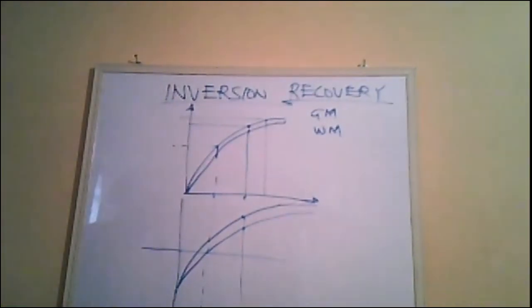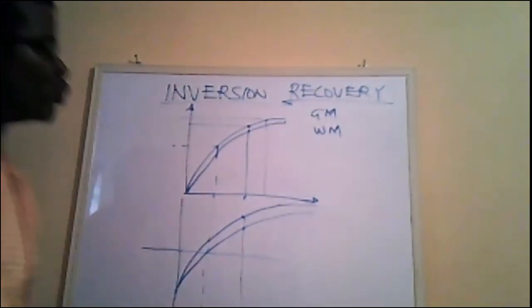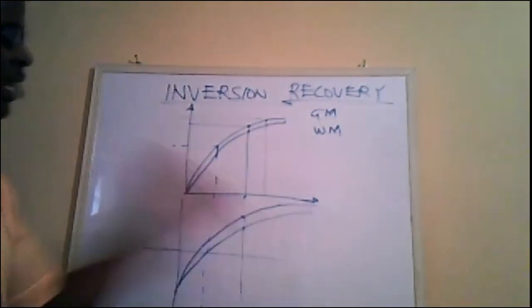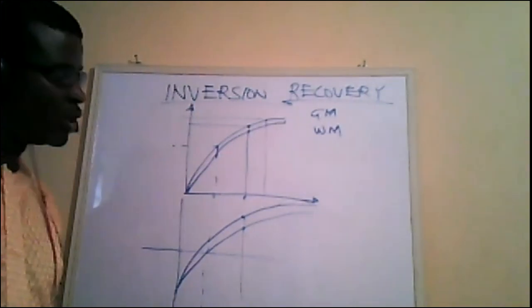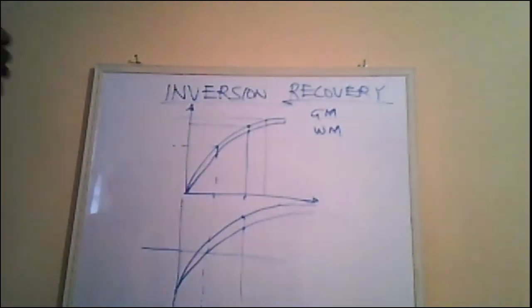So inversion recovery helps us to enhance the contrast of different tissues. It's a very good tool especially when the contrast is based on T1 differences. So that is one use of inversion recovery.